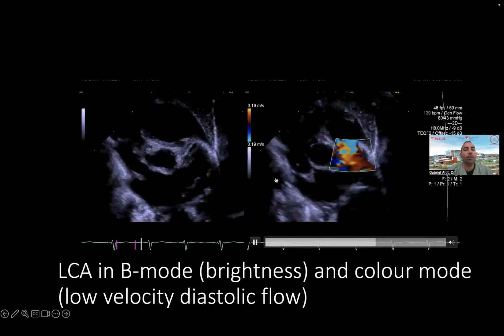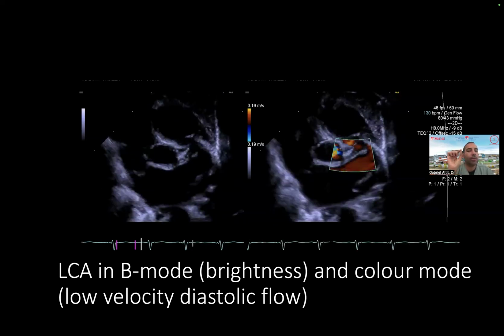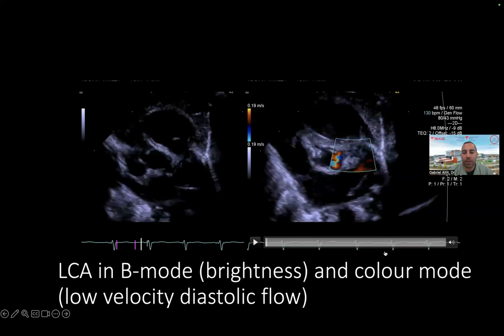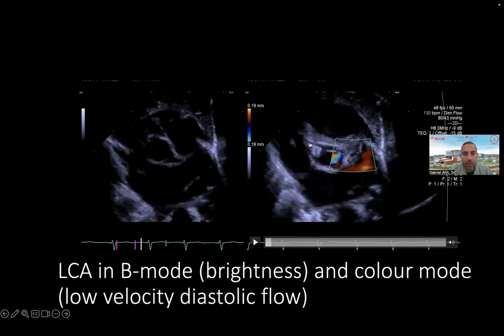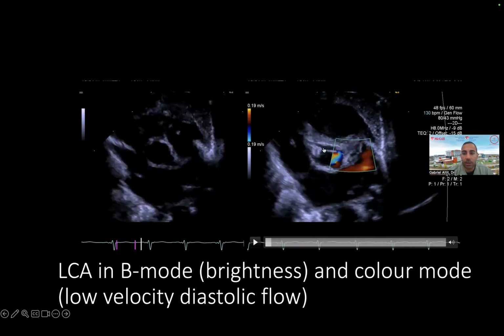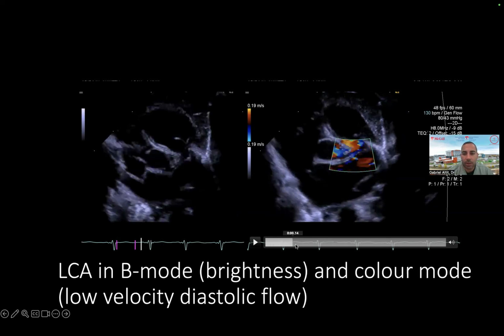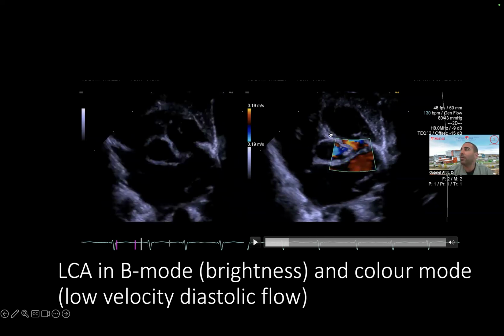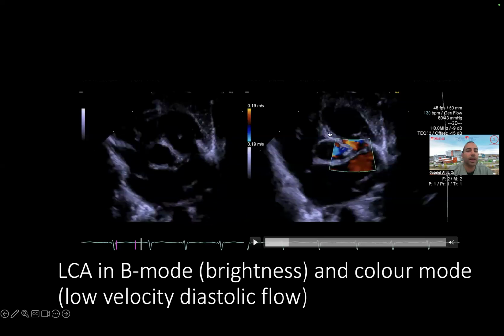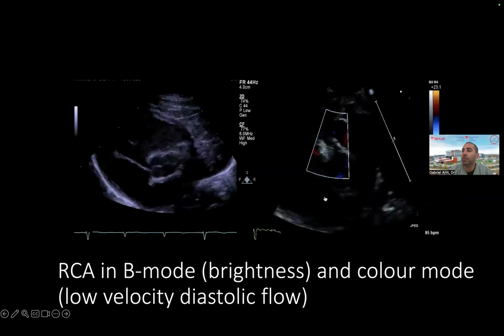You wouldn't see any flow, and you wouldn't see the actual ostium of this coronary coming out of like le bourgeon. Yeah. So I think here, for example, I have an example of that. So here we see, this is the coronary, the right coronary. You see it? Sorry, I realized maybe on the screen. Do you see that line? This is a pericardial fold, right? Because it doesn't connect to the bourgeon aortique. And then here you see nicely the left coronary that's actually coming out and dividing into the circumflex.